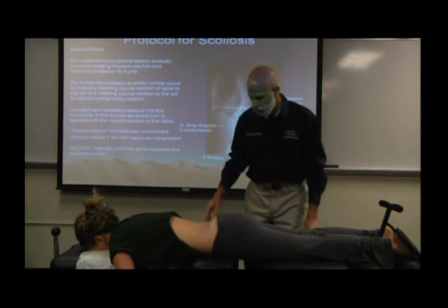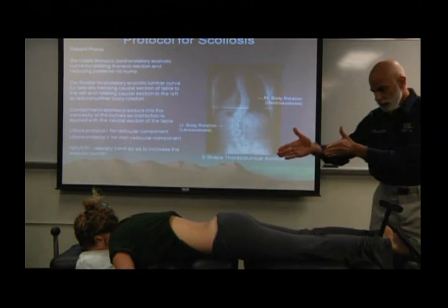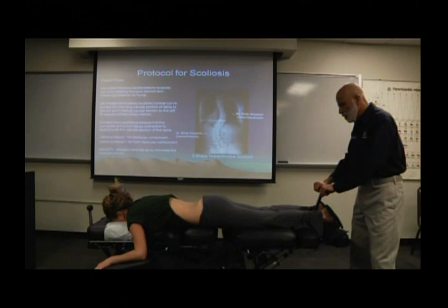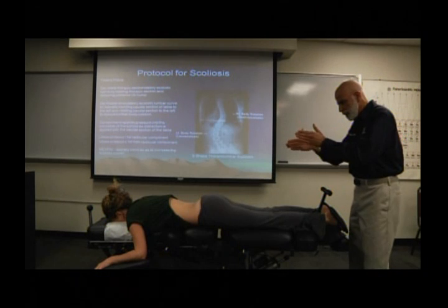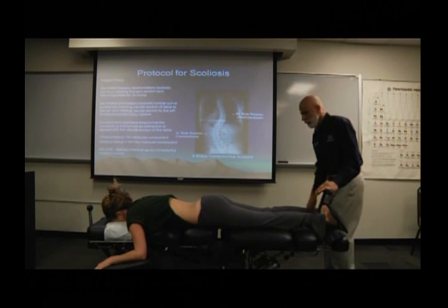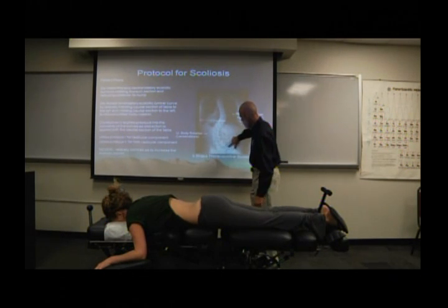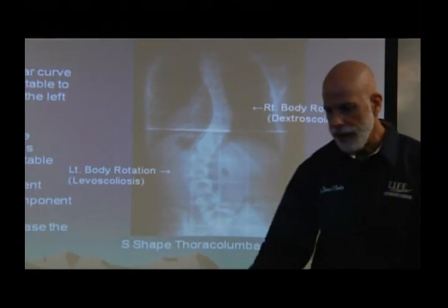So what we're going to do to correct this, it's really simple. We're going to release the lateral flexion lever, and we're going to eyeball her lower back, the lumbar musculature, the erector spinae, and we're going to reduce that scoliosis. And it'll get to the point where you see those erector spinae muscles basically just pop into place, and then you're going to lock the lateral flexion lever. And so all we've done is we've taken measures to reduce that scoliosis and level off those vertebral end plates.